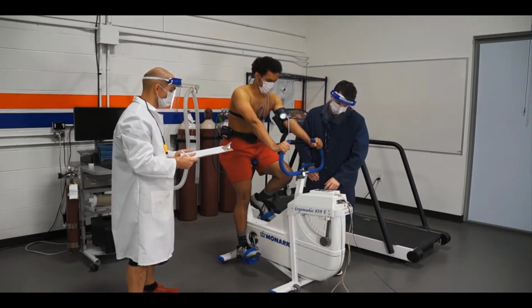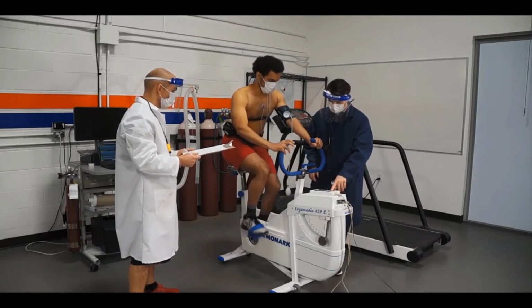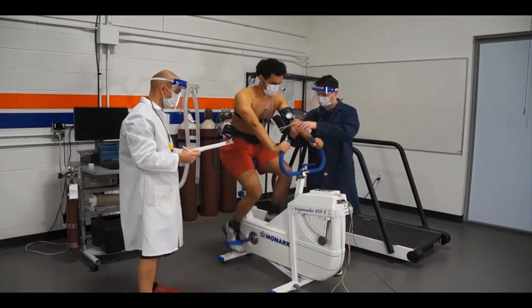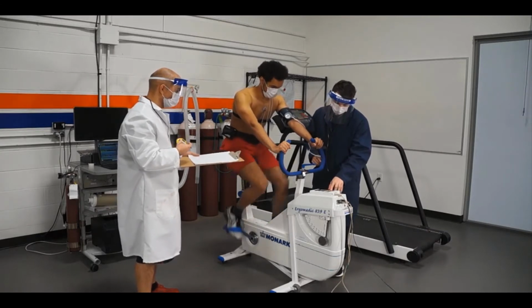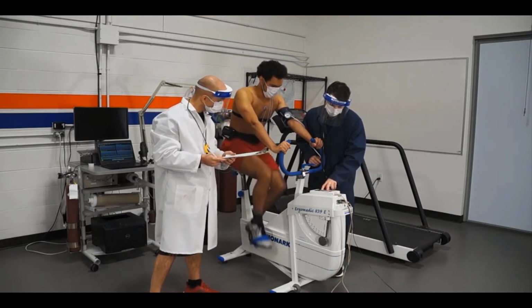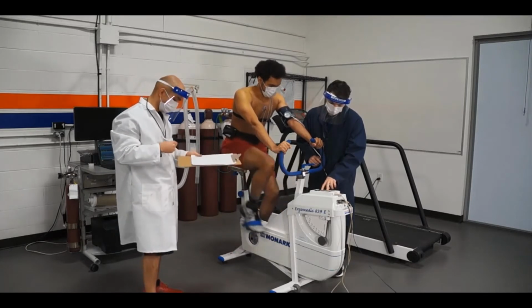So now I just want you watching the same test again, especially if you've watched the direct test video. Now again, focusing on everything we did and how this would not change at all. I wouldn't change the protocol. I wouldn't change anything we did other than the fact that we set him up with some electrodes for that cardiac output measurement beforehand. I really don't monitor that at all during the test. I'm not looking at those numbers at all. It's not anything you can change.